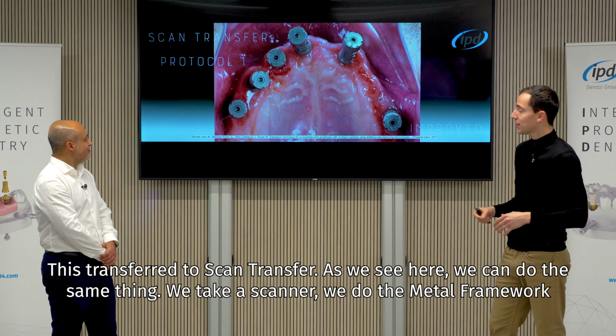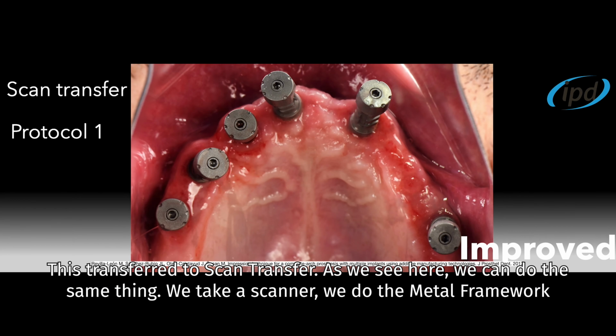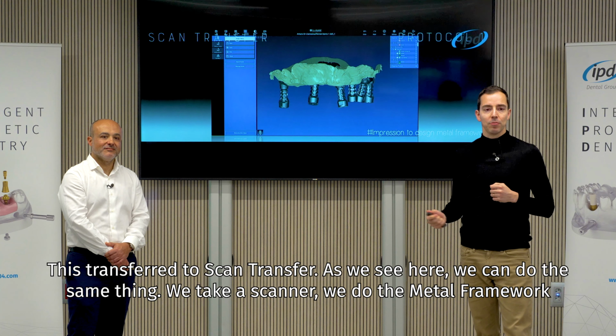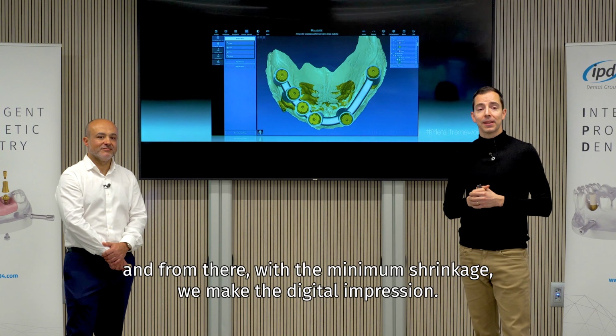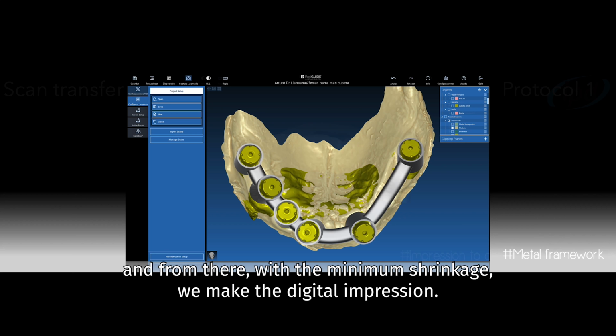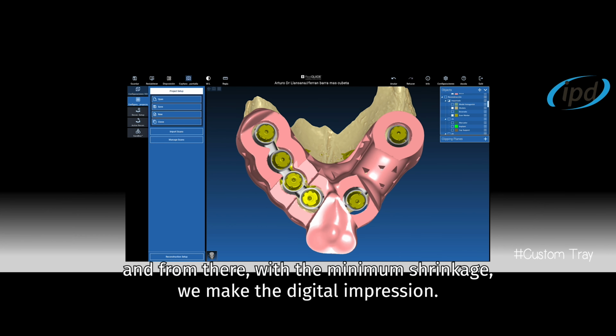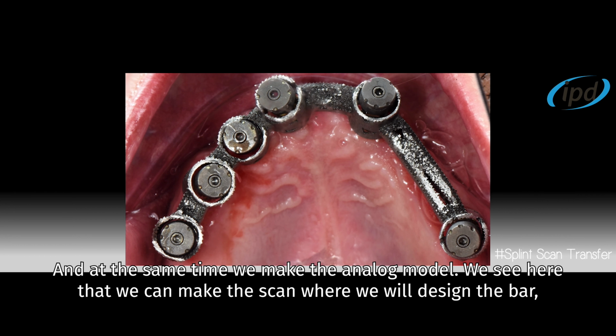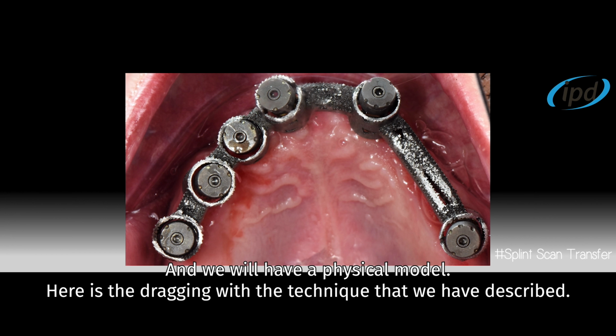This transfer to scan transfer, as we see here, we can do the same thing. We take a scanner, we do the metal framework, and from there, with the minimum shrinkage, we make the digital impression. And at the same time, we make the analog model. We see here that we can make the scan where we will design the bar and we will have a physical model.